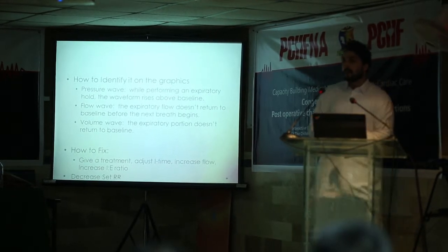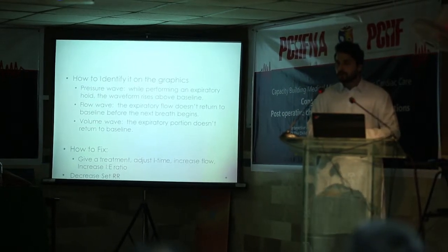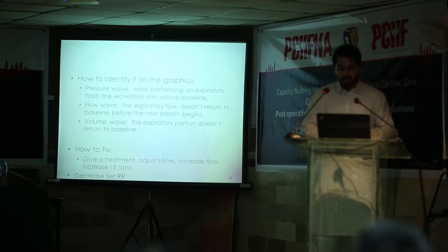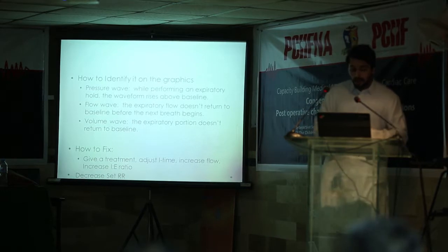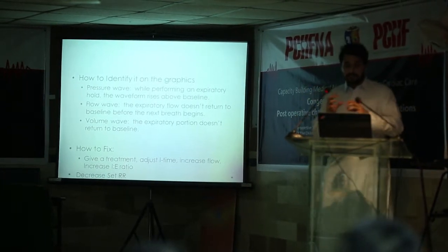So how do we identify air trapping? We can identify it by waveforms: the pressure waveform, the flow waveform, and the volume waveform, which we will come to later on. The main thing now is how to fix it. How do we fix the air trapping or the auto PEEP?